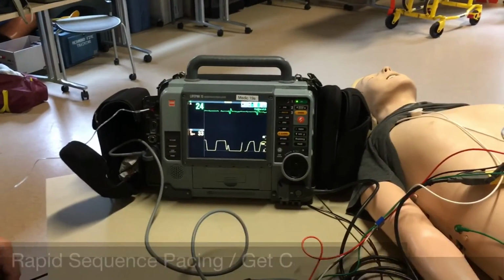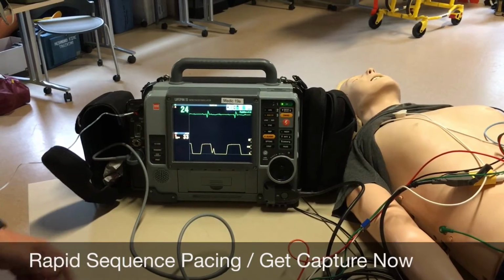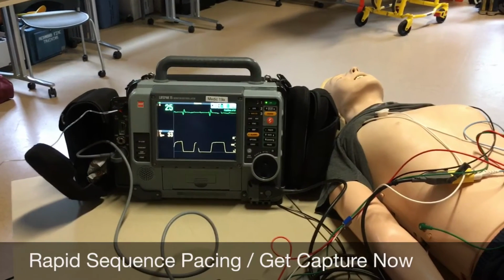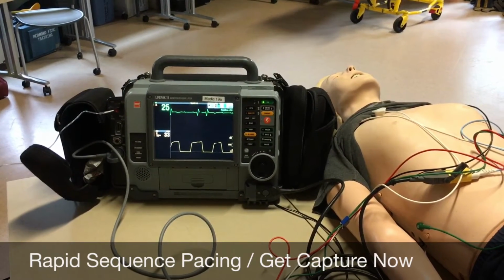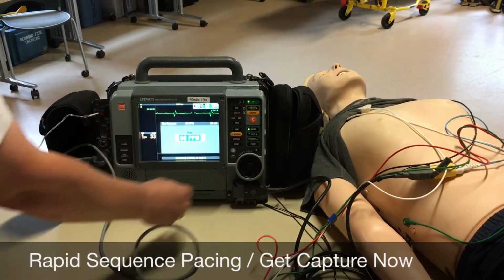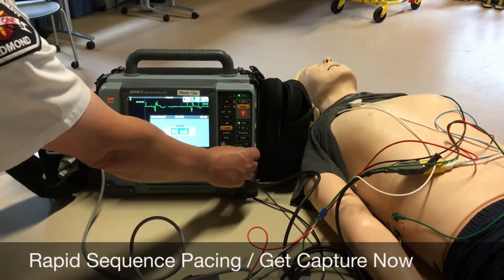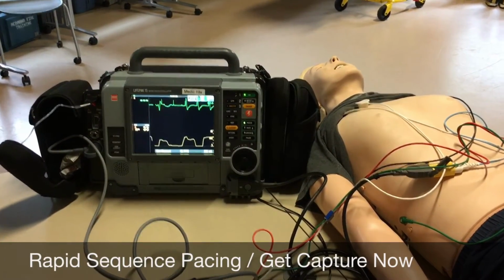So now we're talking about critically ill patients, not patients that you think need a pacer or that we need to have a meeting about, but patients who are critically ill, and if you don't pace them soon, you might be doing CPR. The recommended way of doing that is make sure you have the pads and the leads on, turn on the pacer button, go to the current, click on the current, and then spin the dial all the way up to 200 and get immediate capture.